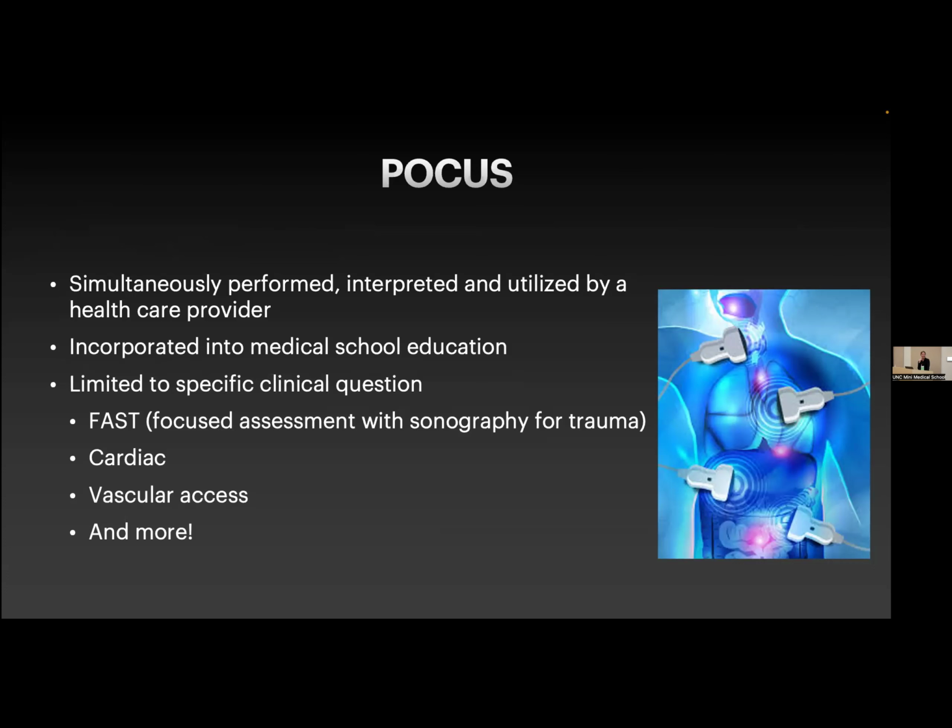We are incorporating it into our medical school educations. That's across the country. More and more schools are using this as a diagnostic tool as our medical students are rotating on their rotations in third year and fourth year. Many of them have access to one of these butterfly probes, and they can go around and see common pathology or common abnormalities and see what it looks like by ultrasound, so that when they're finished with their training, they can feel comfortable using this to make diagnoses and help treat patients.